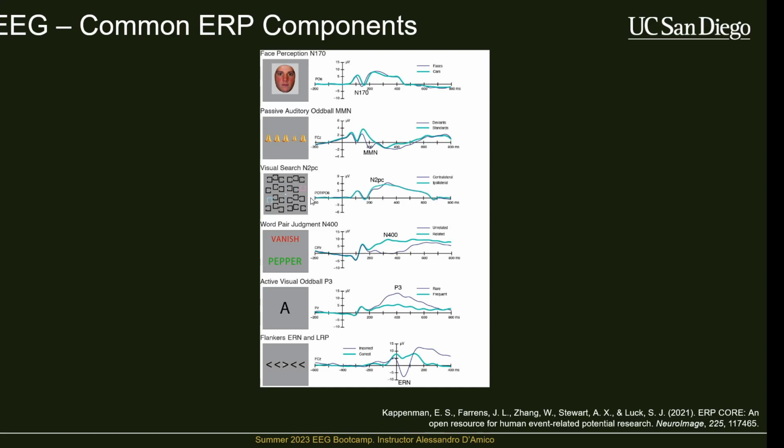It's very dependent on keeping your eyes fixated on the center of the screen because it's essentially a visual field distraction based task. So this is a type of task where you want to be absolutely sure that people aren't moving their eyes. And if they are, you want to discard those trials, because if you move your eyes, then the whole nature of the task has fundamentally changed.